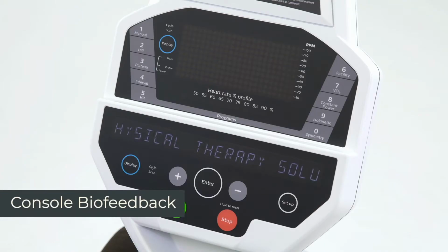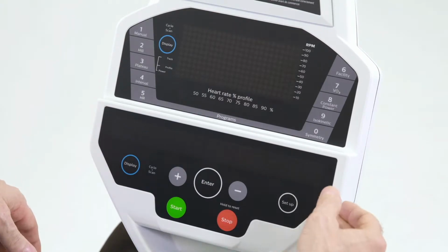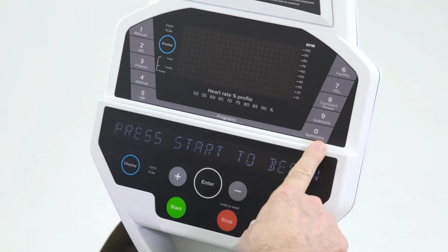We'll discuss the functions of the control panel for the bike. We have many different functions that we're able to do inside the console. We have 3 different resistance modes.